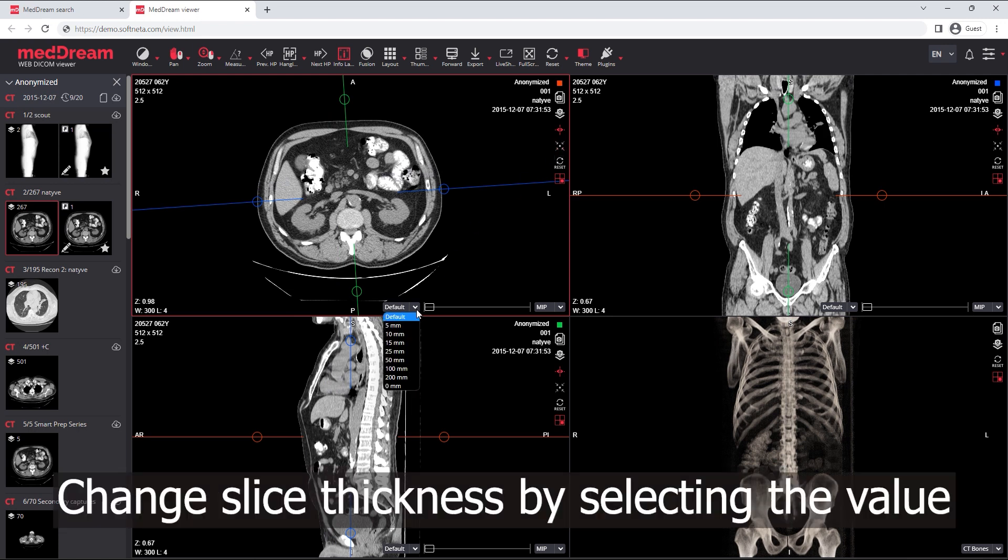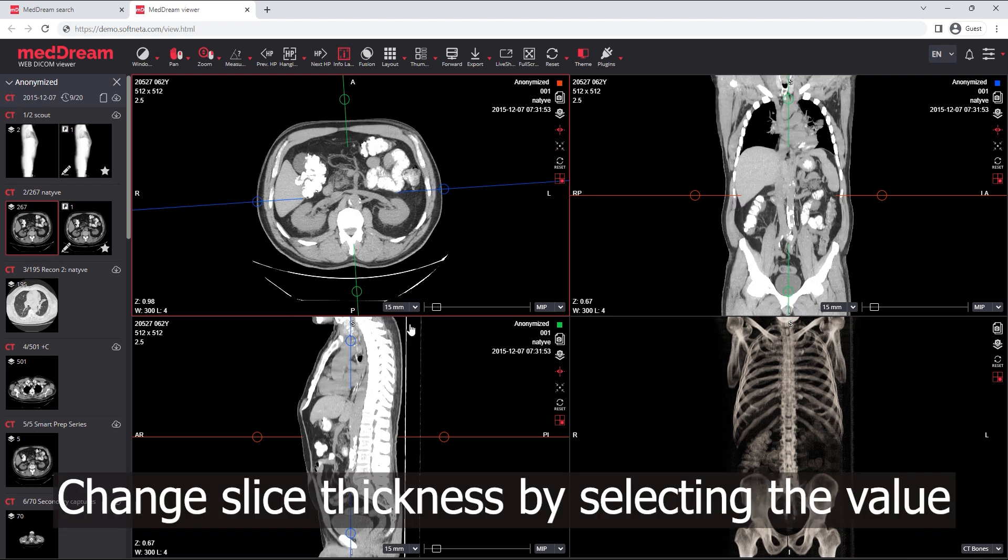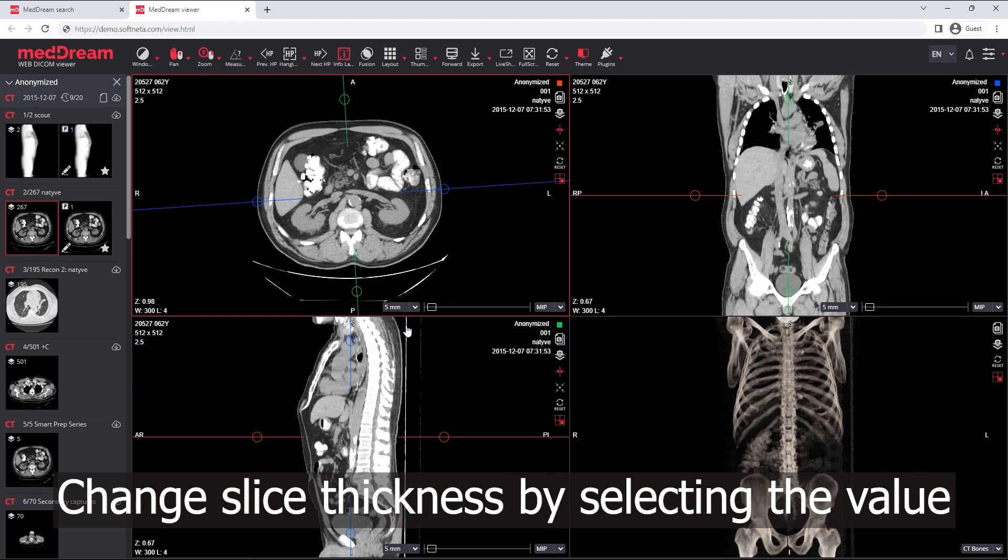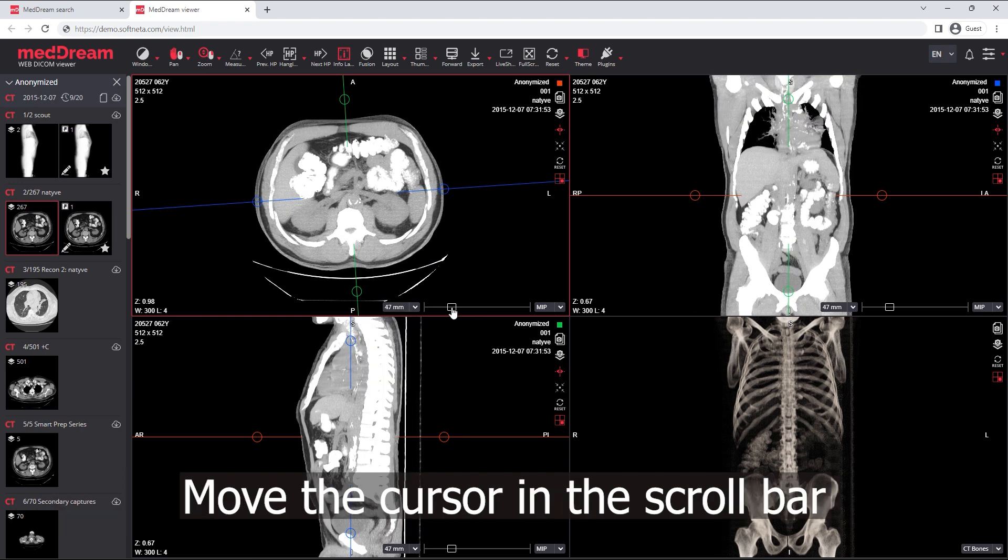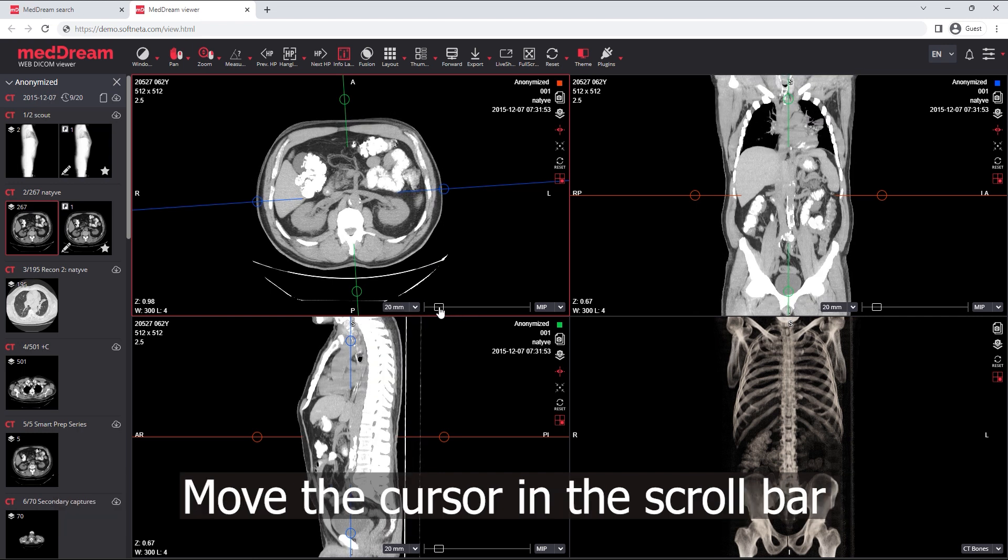Change slice thickness by selecting the value from the list or change slice thickness by moving the cursor in the scroll bar.